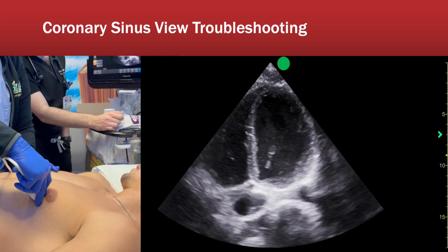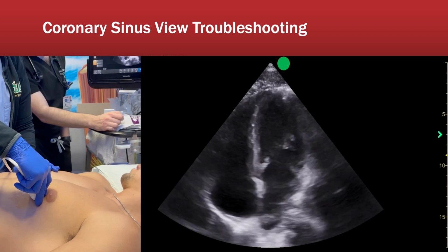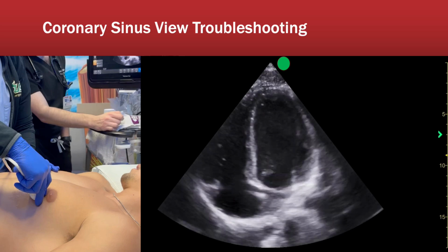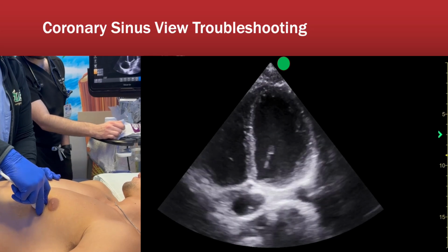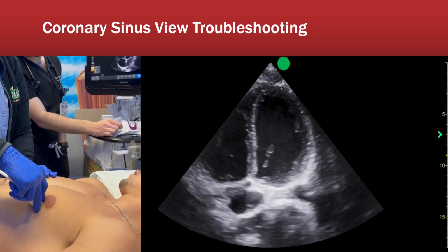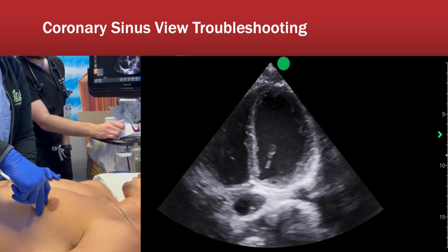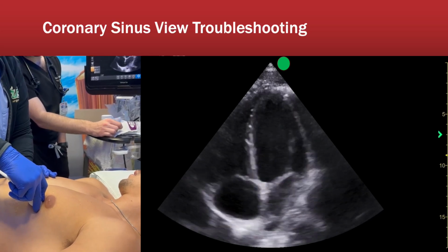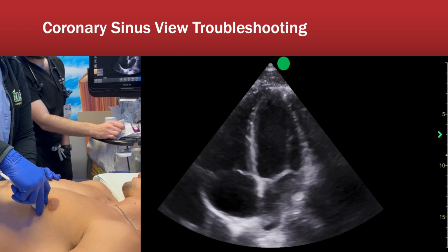On the contrary, if you accidentally obtain the coronary sinus view, like we have here, all we have to do is the opposite of what we did for the apical 5-chamber view. In this case, all that means is the tail of your probe is too cephalad, so you have to fan it down slightly just to get a view of your atriums.